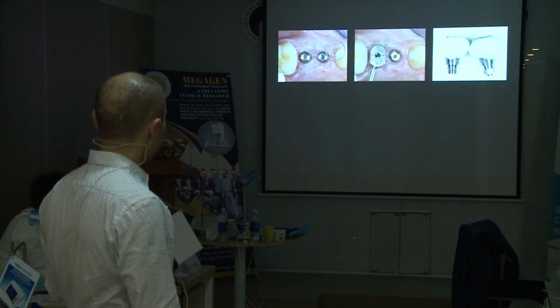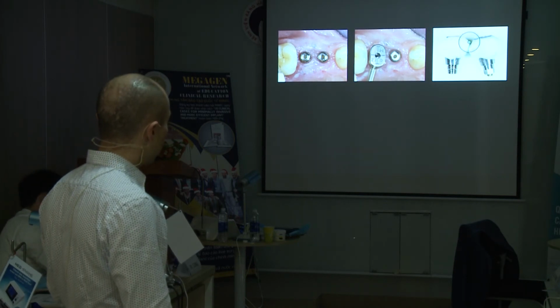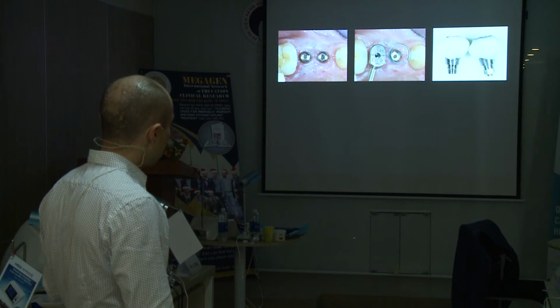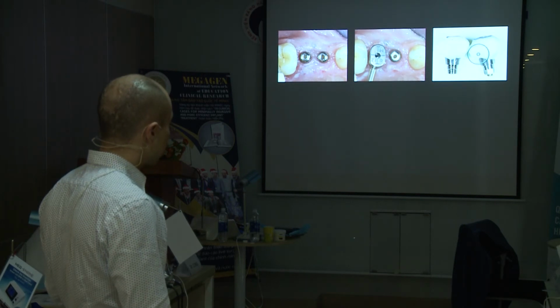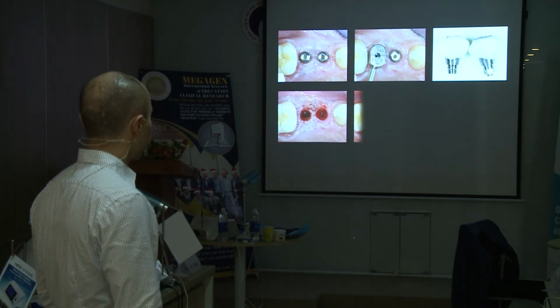I take out the healing abutments and I make new temporary abutments with the cervical shape that I want to create.